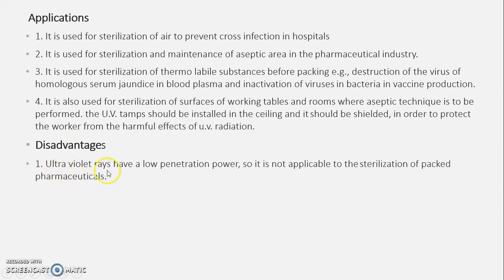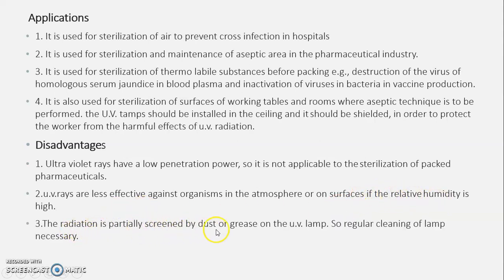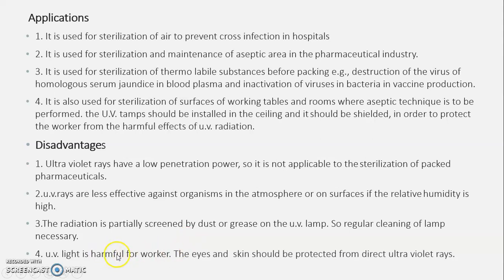Disadvantages include: ultraviolet rays have a low penetration power, so it is not applicable to the sterilization of packaged pharmaceuticals. UV rays are less effective against organisms in the atmosphere or on surfaces when the relative humidity is high. Then radiation is partially screened by dust or grease on the lamp, so regular cleaning of the lamp is necessary. UV light is harmful for the workers. The eye and skin should be protected from the direct UV rays.